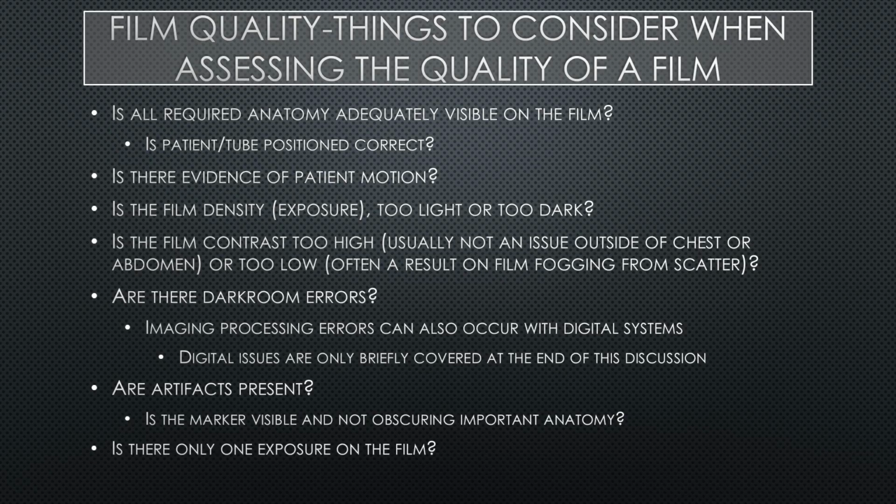Are there any darkroom errors? That's only if you are processing actual film, but there will be other processing errors that you can see on computer or digital systems. Are there any artifacts present, whether it's outside of the patient, like on the patient's person, jewelry, or something like that? Or is there other type of artifacts, such as the marker? Is there only one exposure on the film? There can be instances of double exposure.